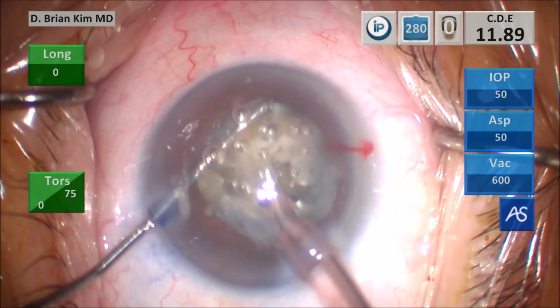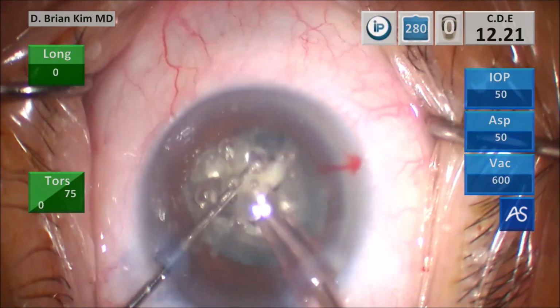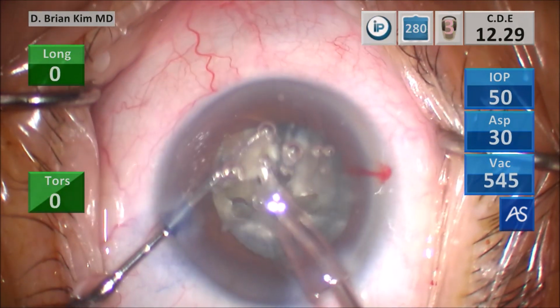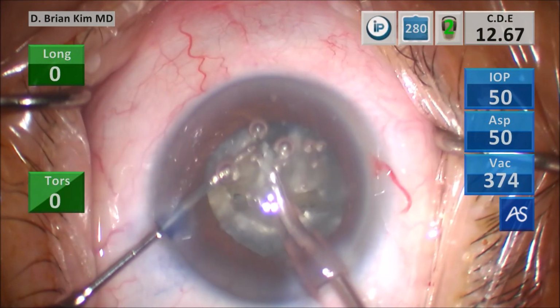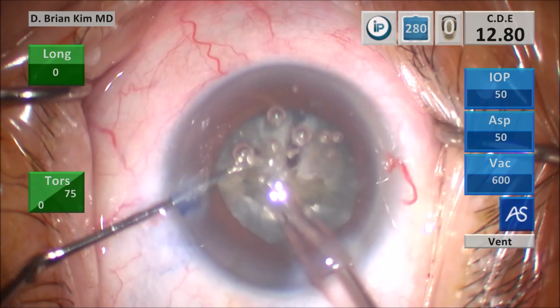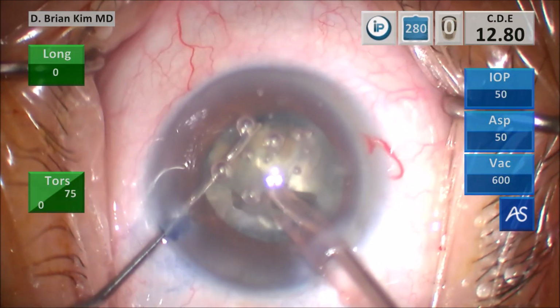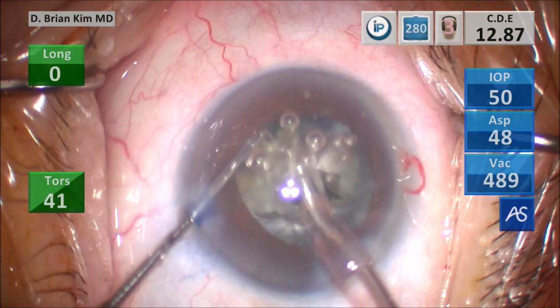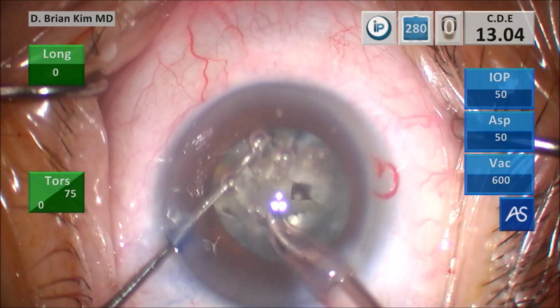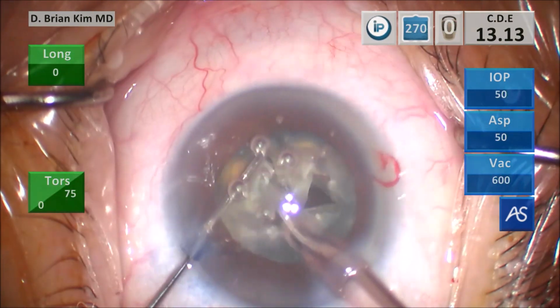crush the lens pieces into smaller pieces, and then emulsifying the lens piece. You can see that there's all these bubbles on the cornea because the bubbles are stuck within the dispersive viscoelastic. I'm intentionally leaving those bubbles there, and I'm performing the lens disassembly technique, fracturing the lens into smaller and smaller pieces, using sparing amounts of ultrasonic energy and vacuum, and keeping that port away from the cornea.